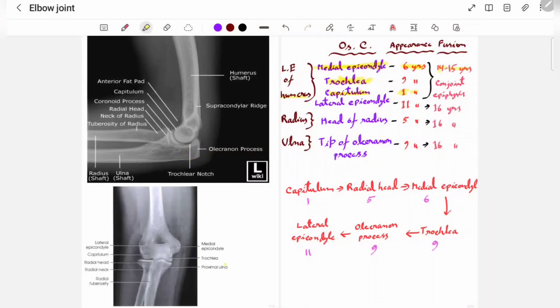In this video we will discuss the elbow joint and age determination by elbow joint X-ray. The anatomical structures we have to examine are: first, the medial epicondyle; then the lateral epicondyle; the capitulum; and the trochlea. These four structures of the lower end of the humerus are important for age determination. In the lateral view, we also examine the lateral epicondyle, the head of the radius, and in the ulna, the olecranon process. These six structures in total are important for age determination.